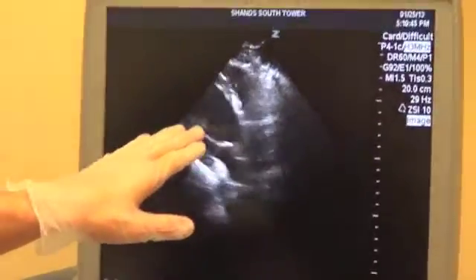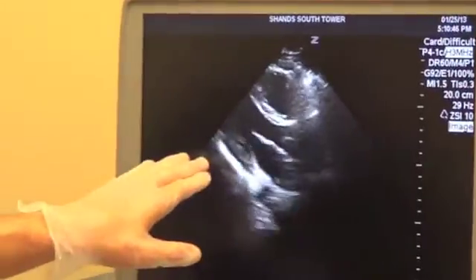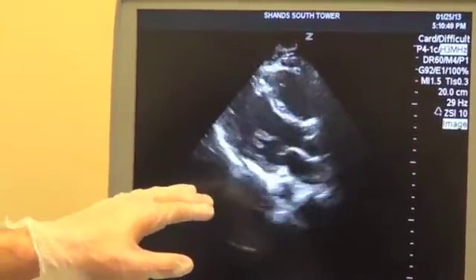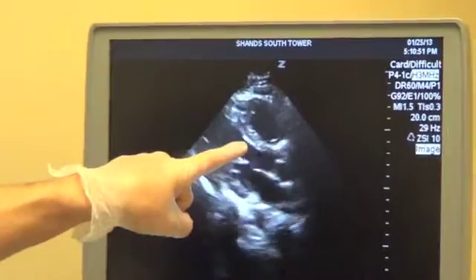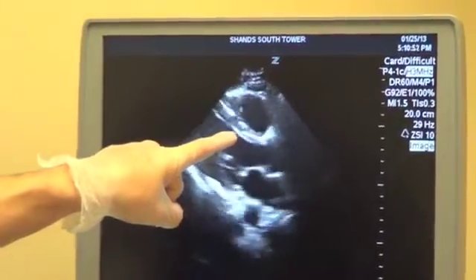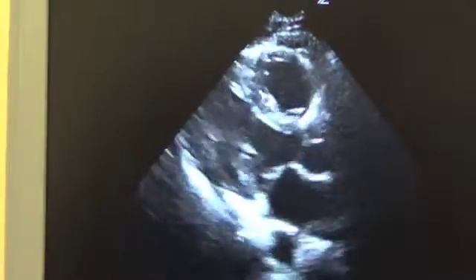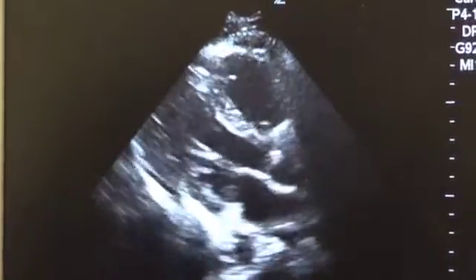After assessing fractional shortening, we go on to assess left ventricular wall thickening. We want to ensure that both the septal as well as the posterior wall thicken 40% to 50% with contractions, as they do in this case. During systole there is 40% to 50% thickening of the muscles. Again, this can be quantified in M-mode.